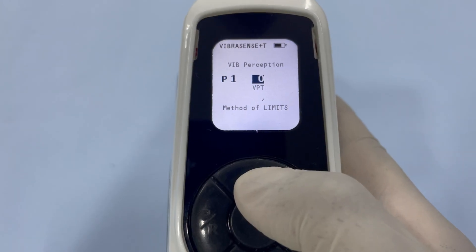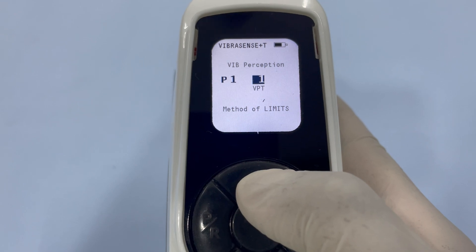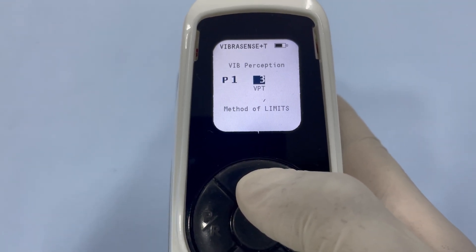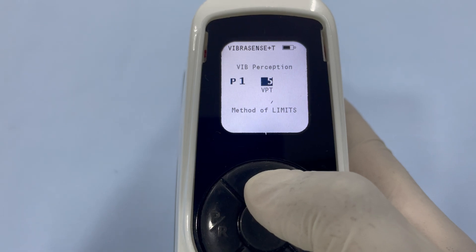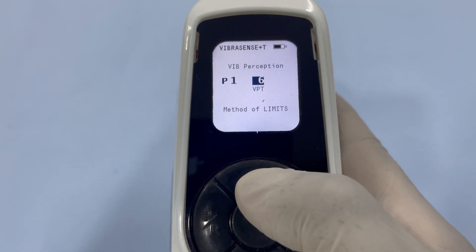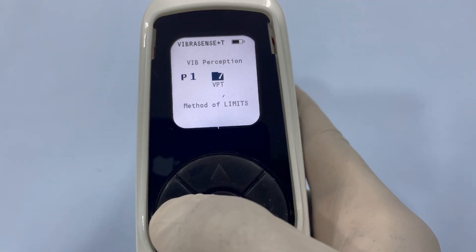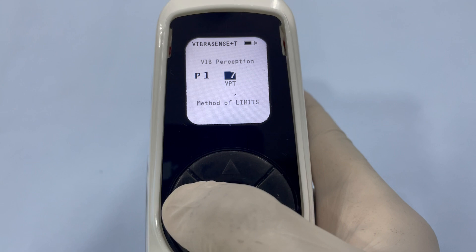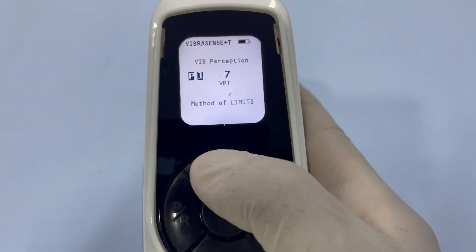Slowly increase the amplitude of the vibration stimulus using the up arrow until the patient confirms feeling the sensation. After testing at P1, press the PR button to save the recorded data and bring up position 1 on the screen.